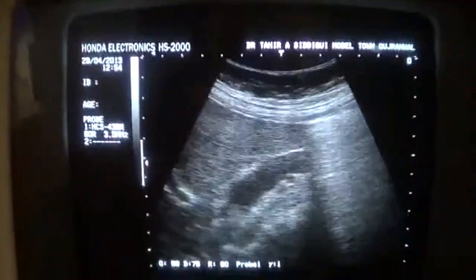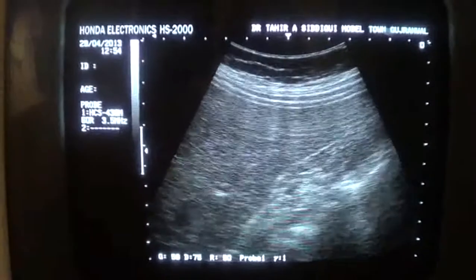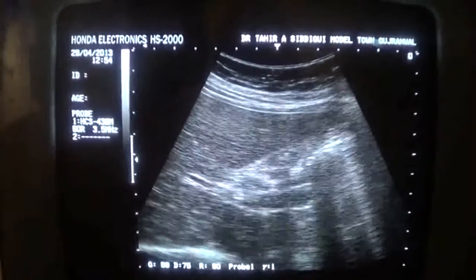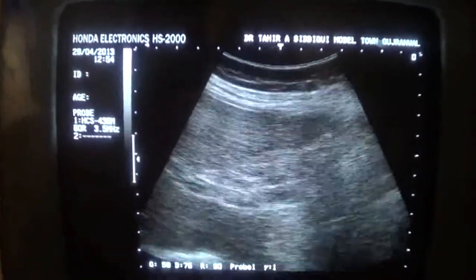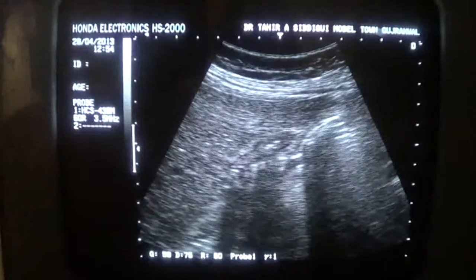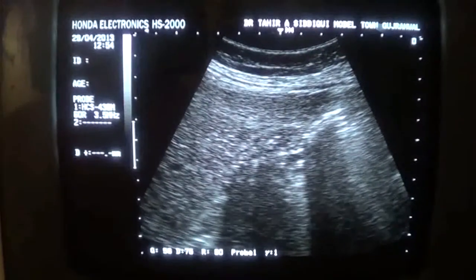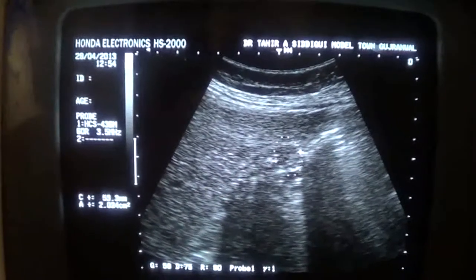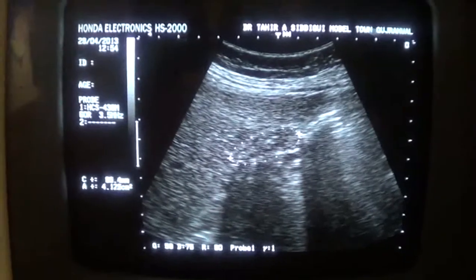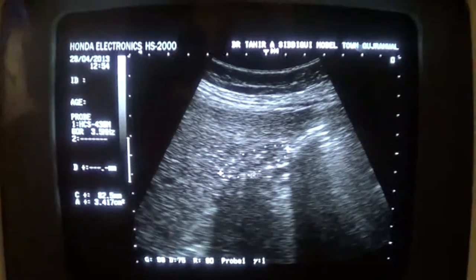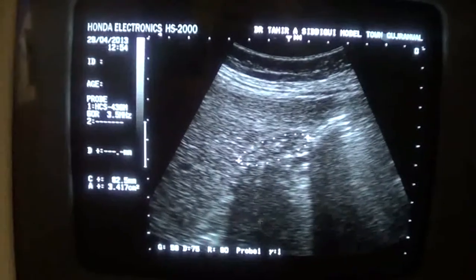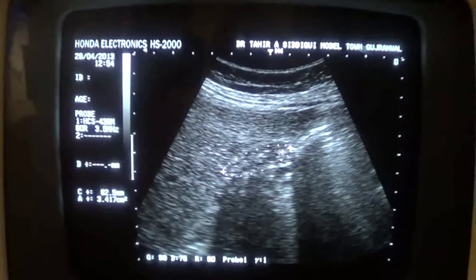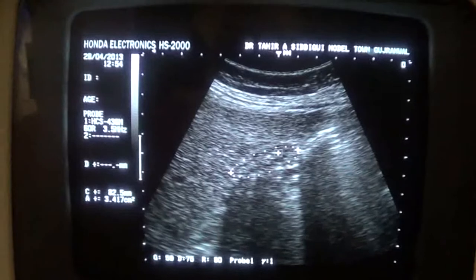Let's see it from another position. Now, this is the patient in left lateral decubitus posture, and this is the gallbladder. Now here you can see the posterior wall clearly. Though shadowing is seen, these are the echogenic particles — the calculi — within the lumen of the contracted gallbladder.